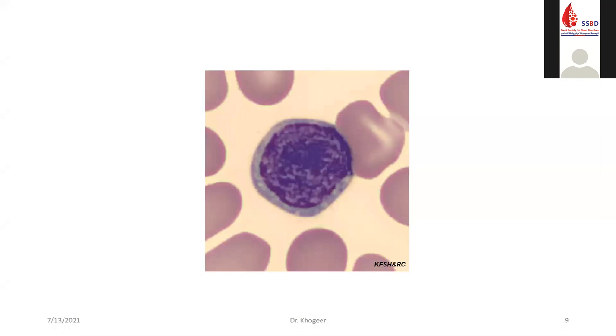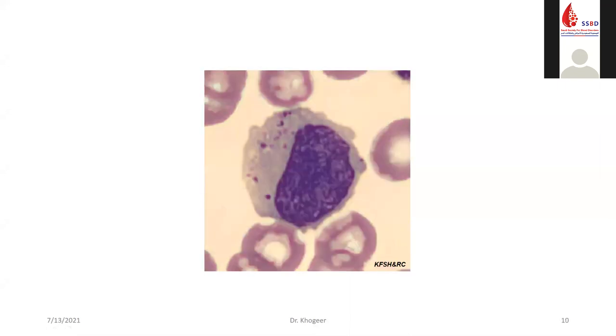This is a typical lymphocyte, which is slightly larger than a normal RBC, with scant to moderate pale blue cytoplasm, round nuclear contour, mature chromatin, and inconspicuous nucleoli. This is a large granular lymphocyte, which is a medium to large cell with a round nucleus, dense chromatin, and no visible nucleoli. The cytoplasm is moderate to abundant, clear and lightly basophilic compared to the previous typical lymphocyte, and contains several coarse, unevenly distributed small azurophilic granules.